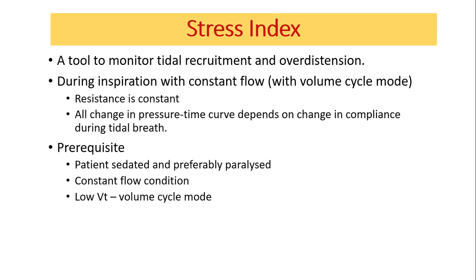I'll talk about flows and curves in the next one. So whenever the flow is constant, all the changes in the pressure time curve, we're going to look at the pressure time scalar. Okay, the pressure time scalar which is right on the top. Pressure time, then flow time, then volume time. These are the three scalars which you see on your screen. So the pressure time is right at the top.